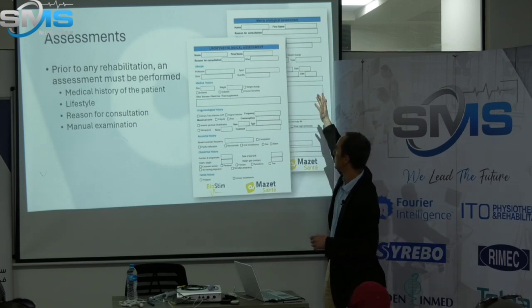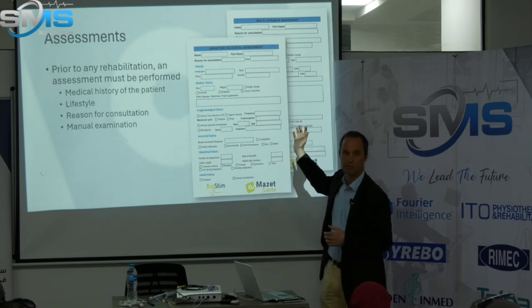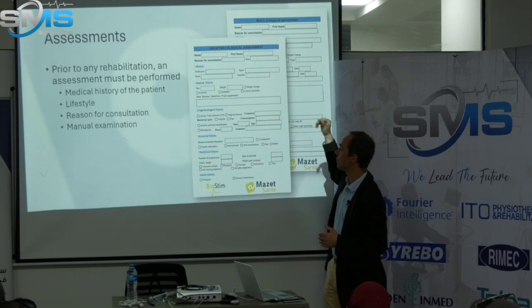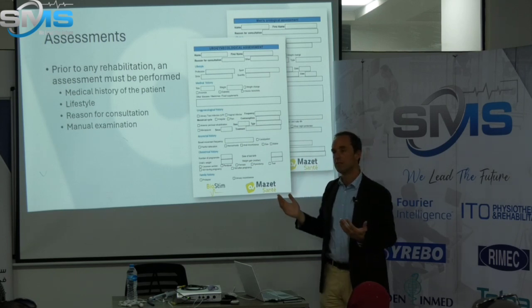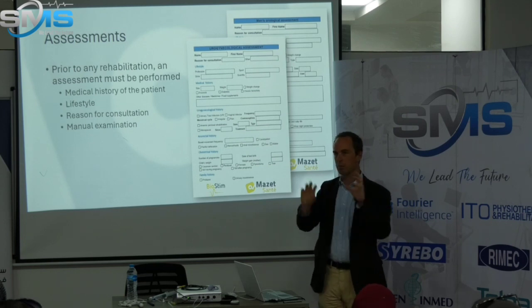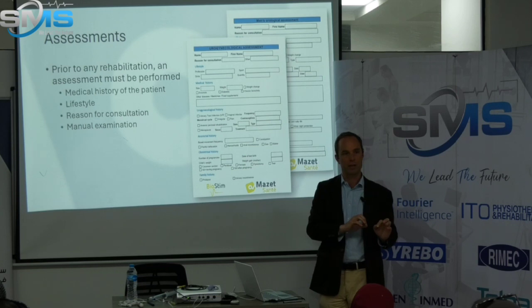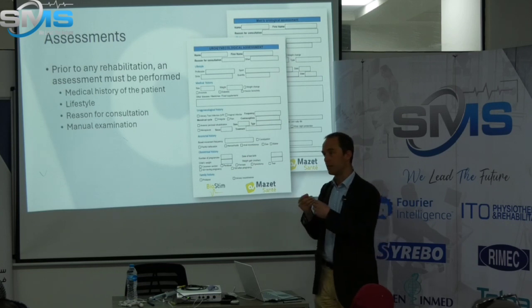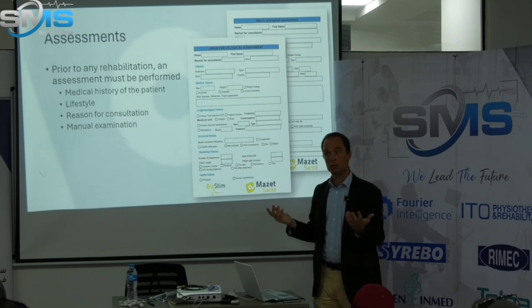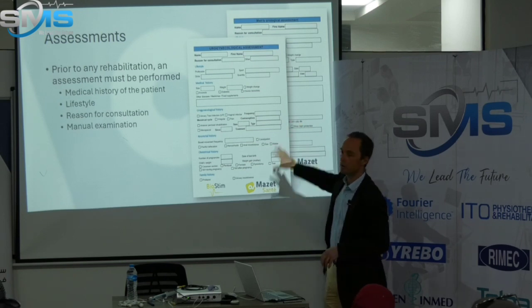You can use whatever form that you have. The important thing is that you must discuss with your patient and understand exactly what could be the problem, because there can be many different ones, and your patient might not tell you everything the first time because she's shy, because it's intimate, because sometimes she doesn't know. She can feel a problem, but she cannot understand how and when. And that's very important to prepare this assessment.